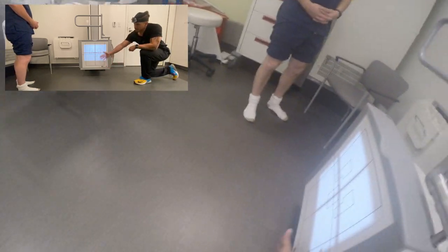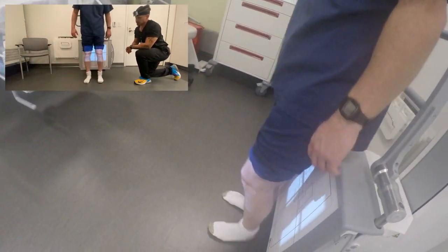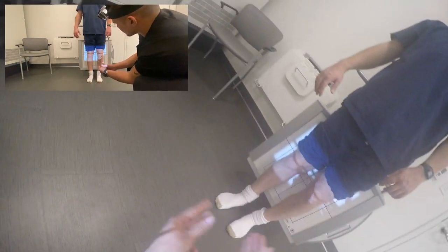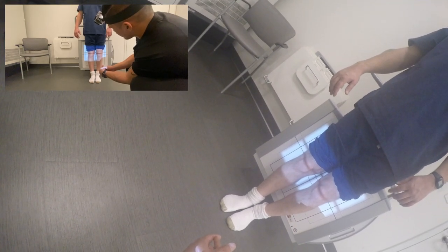You're going to stand over here, back against the board, facing the camera. Let's slide over to your left a little bit. Good. And then get your knees closer together if you can. Yeah, that's actually pretty good.